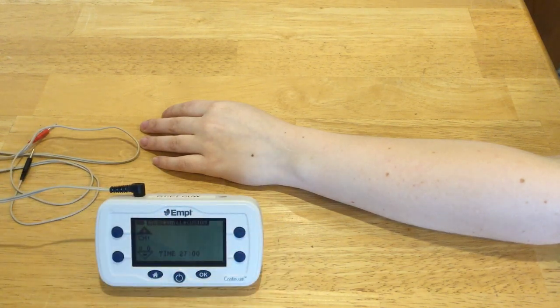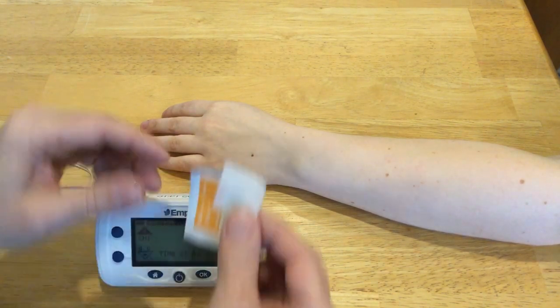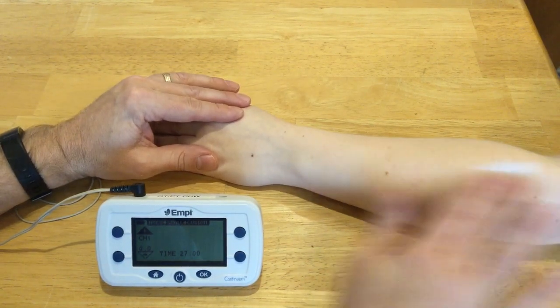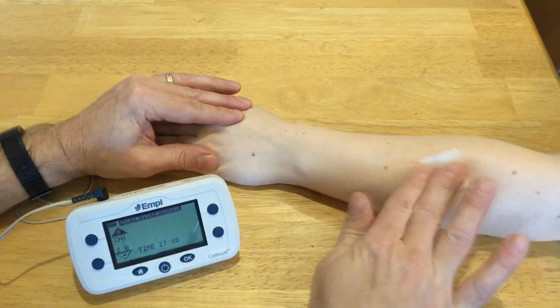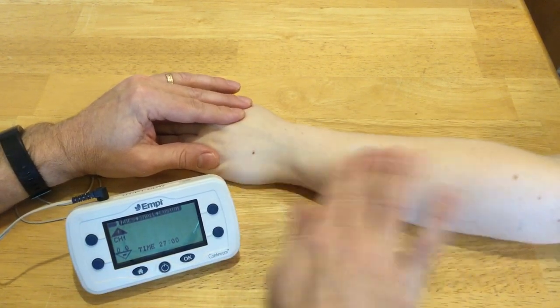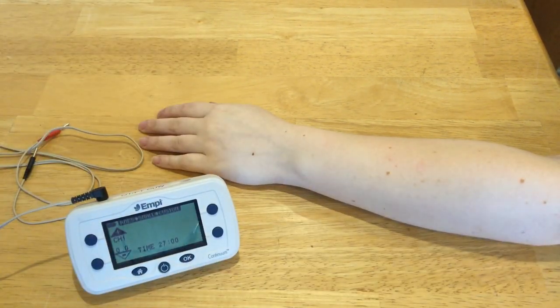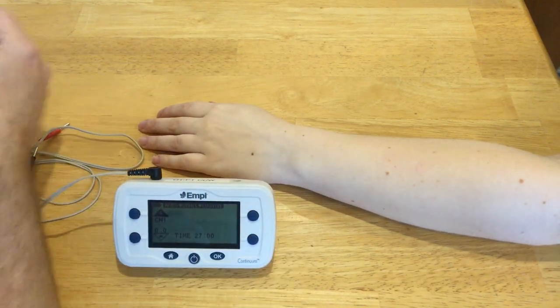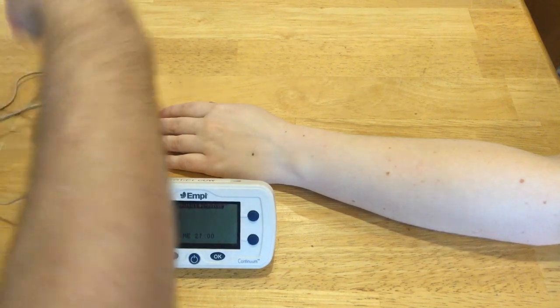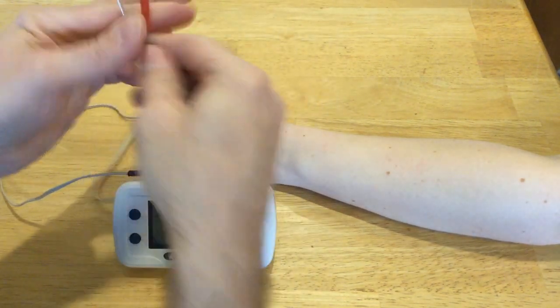We have to get some electrodes going, so I'm going to take my alcohol wipe and clean the area where I want to put my electrodes. I'll put one there and then one a little more distal. I did choose an asymmetrical waveform, so the color of these electrodes will matter.